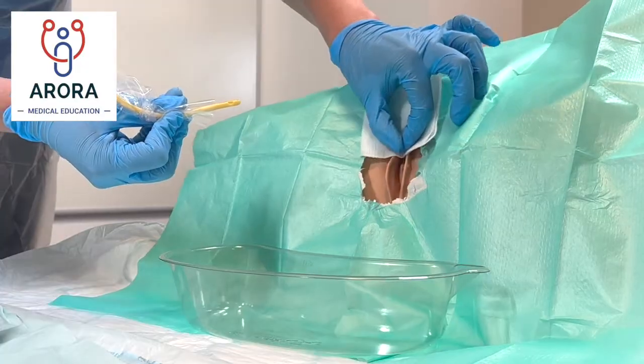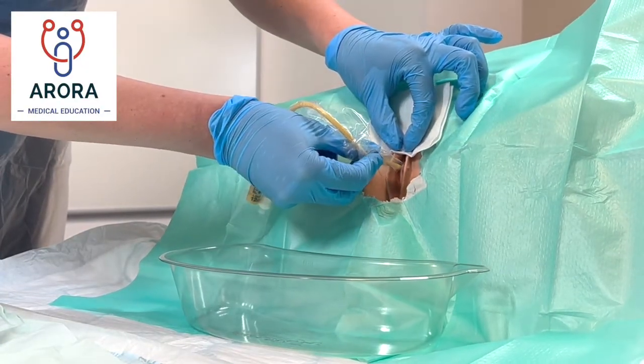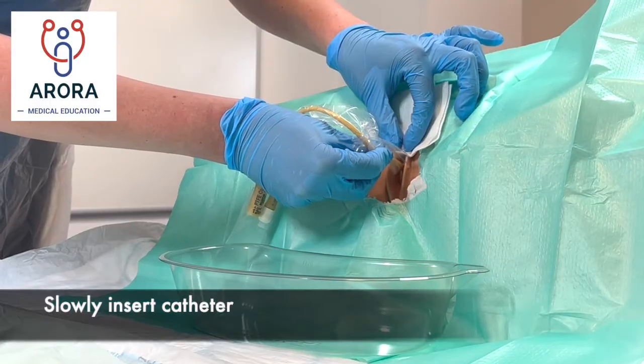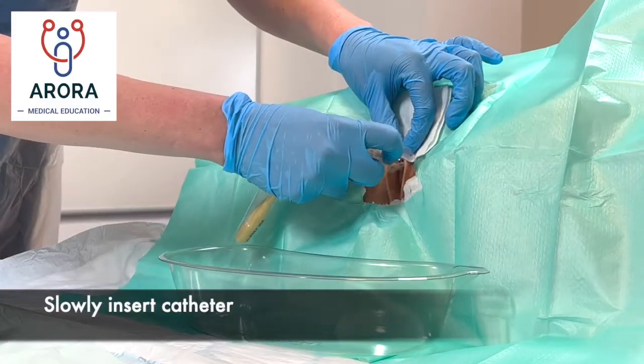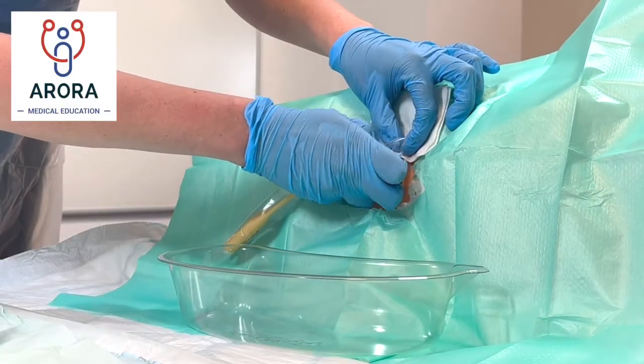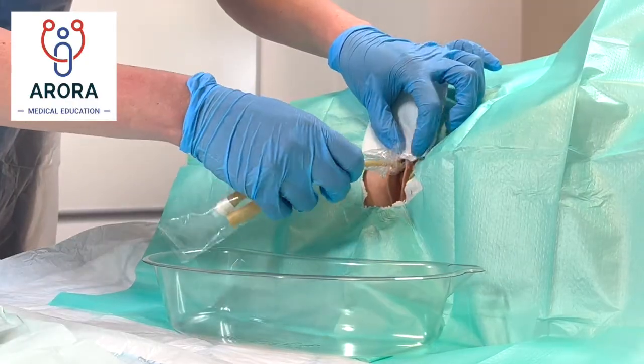Now we're ready to insert the catheter. Gently part the labia again with some gauze and insert the catheter, checking with the patient that they're comfortable and that there's no pain at all times, slowly advancing and checking for any resistance.